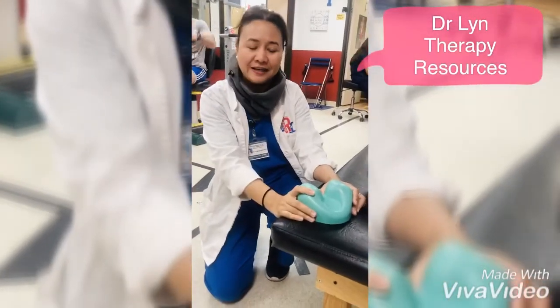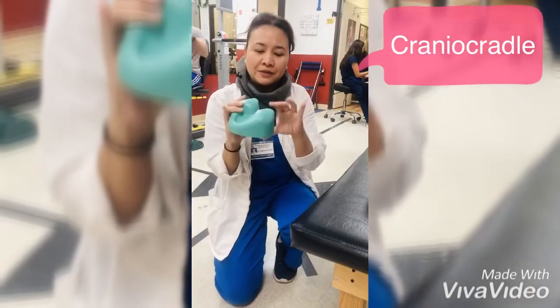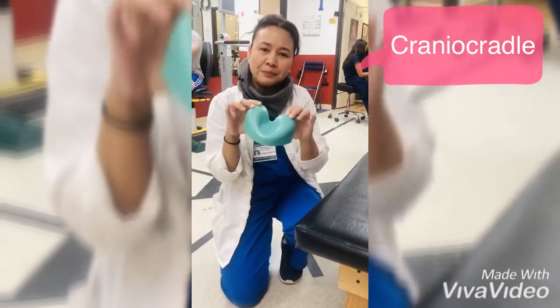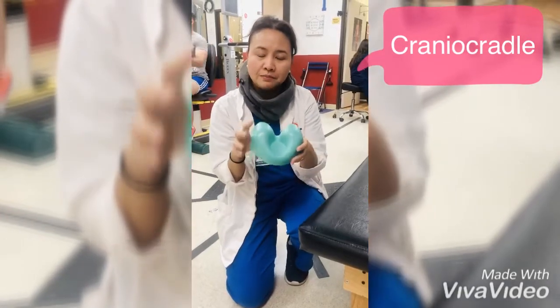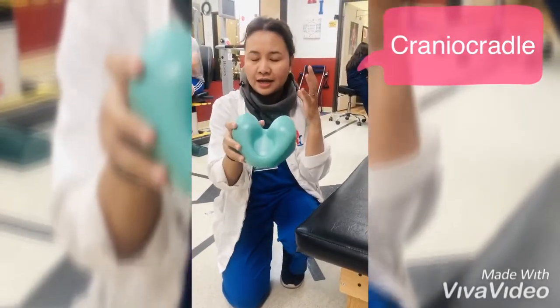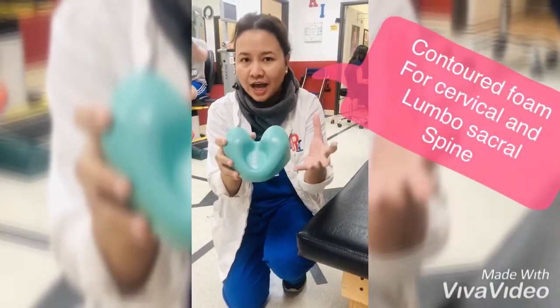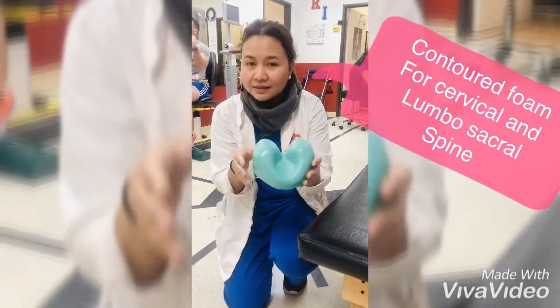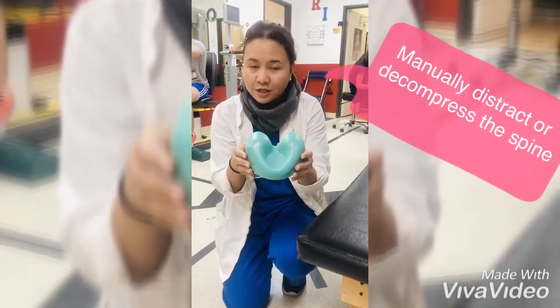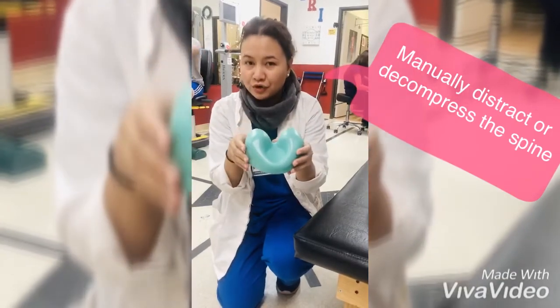Hi, this is Dr. Lynn. Today we're going to use the cranial cradle, which is a firm cushion that is contoured on the cervical area and the spinal area, or the lumbar area. We're going to use this to manually distract the cervical spine so that we can help decrease the pressure of the movement.